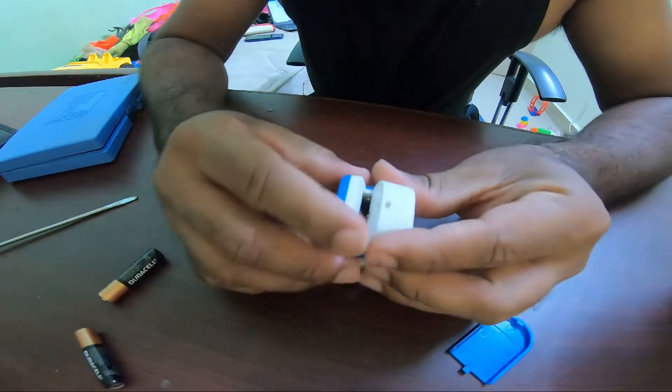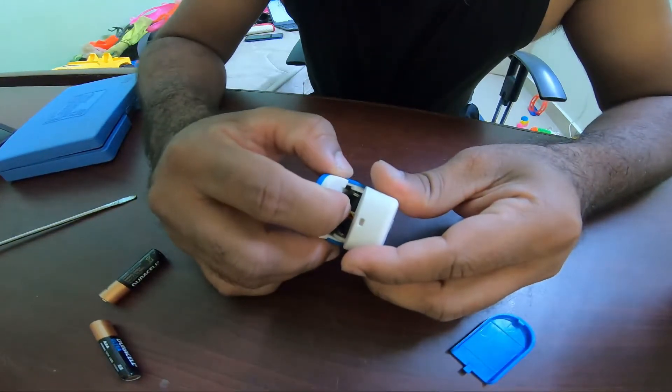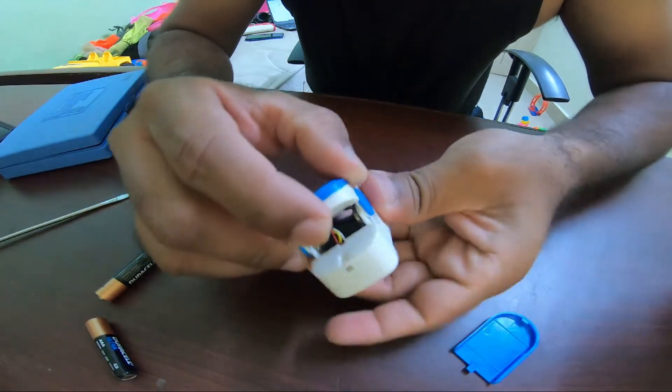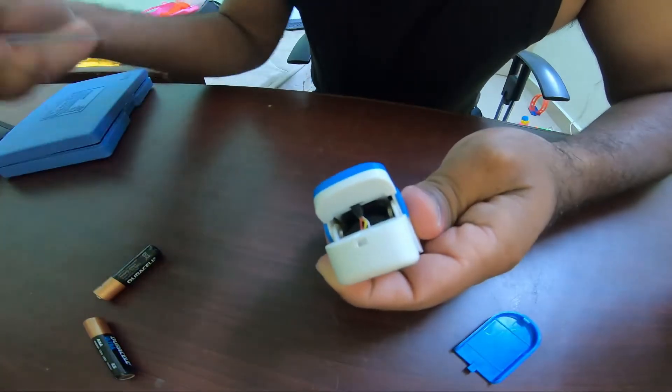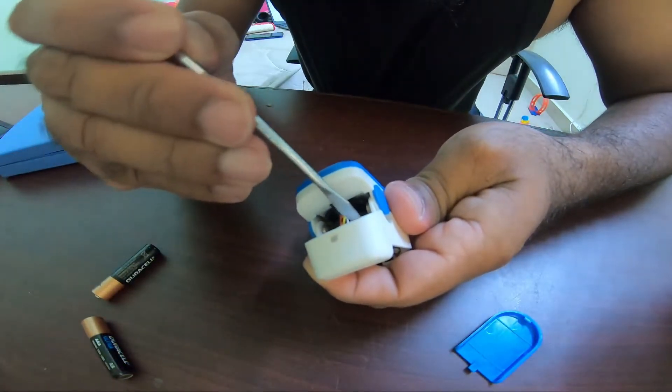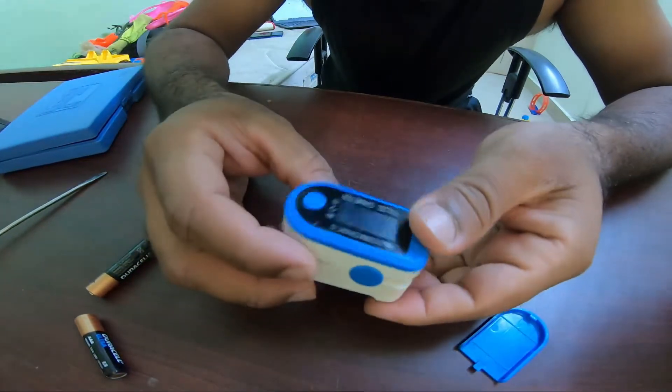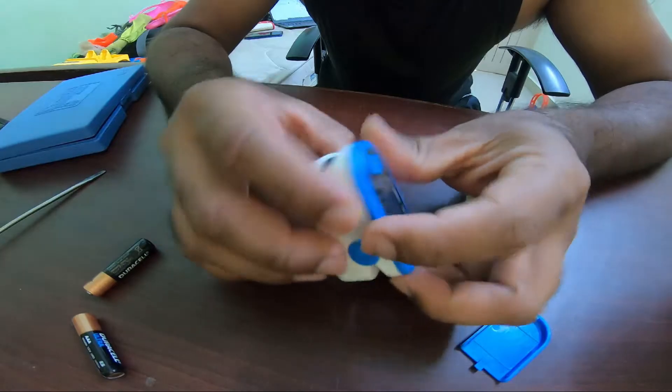This happens because every time we put our finger in, the wires get stressed and disconnected. If you look closely, one of the wires — the black wire — has disconnected. Let me show you how we can troubleshoot this.